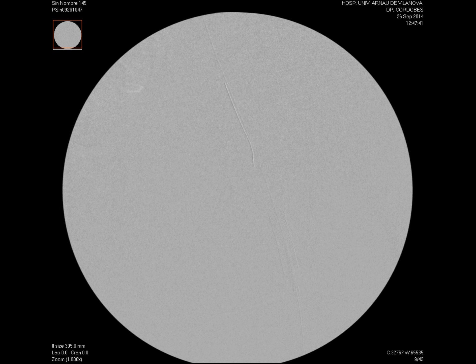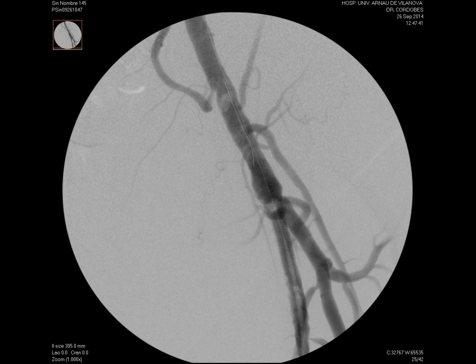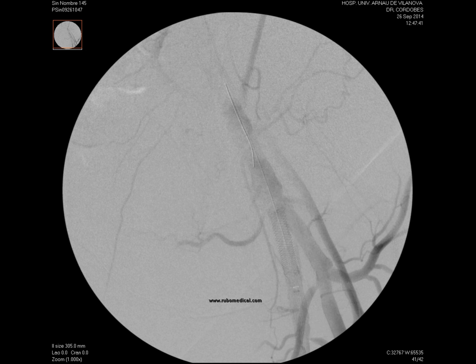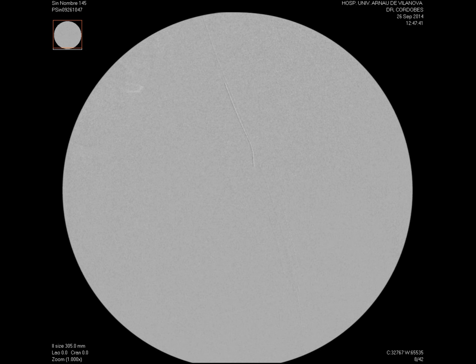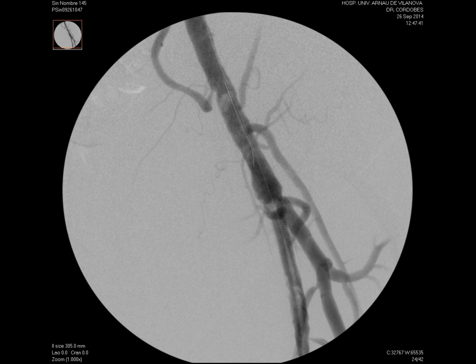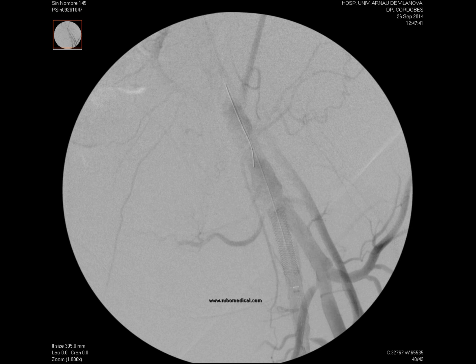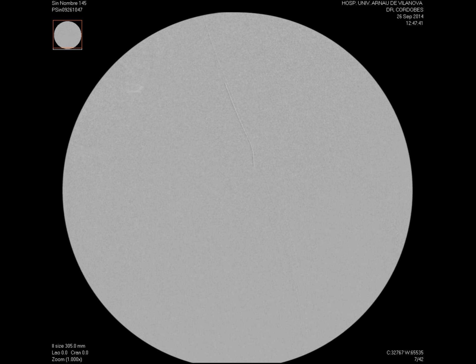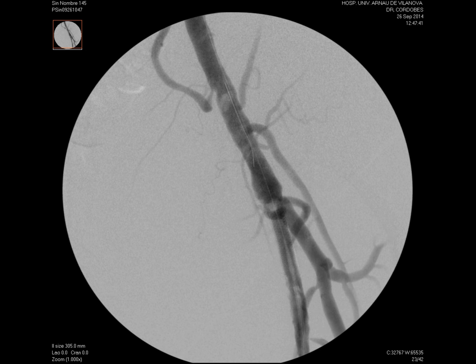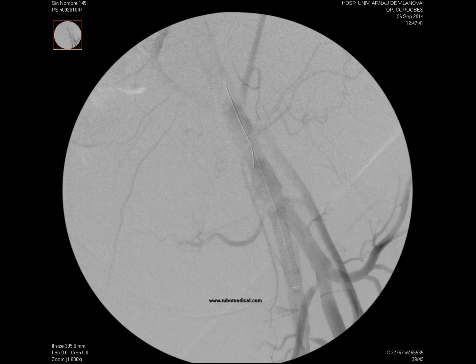We remove the guidewire from the antegrade approach and proceed to release the stent. In this angiography we can see how it is perfectly positioned. It should be noted that the friction of the carrier system with the skin forced us to perform a pull-back release to achieve the correct deployment.